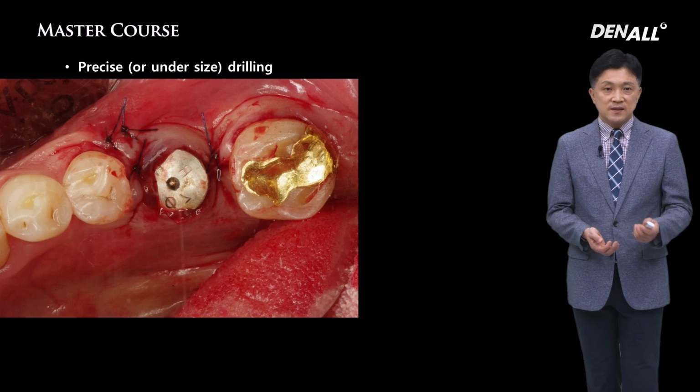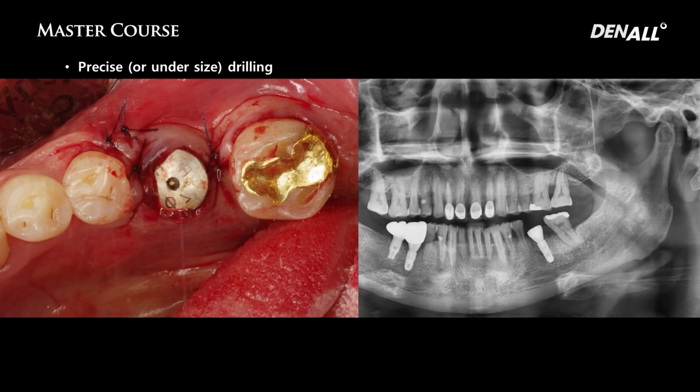Compared with traditional GBR, it's more simple, and this is a big benefit in terms of immediate implant placement. By doing this, you can get regenerative help from the surrounding periodontal ligamentous cell. A more positive regenerative outcome can be gained. Implant has been placed.